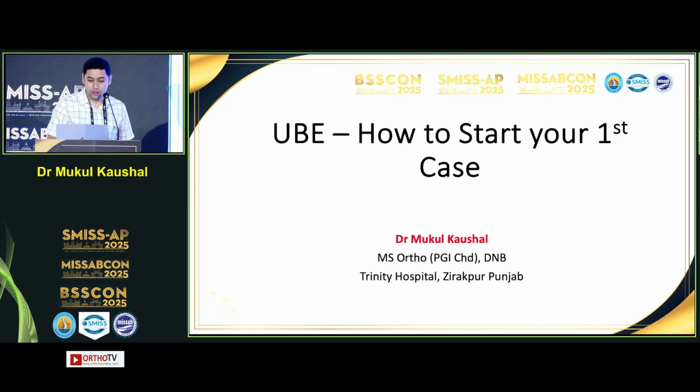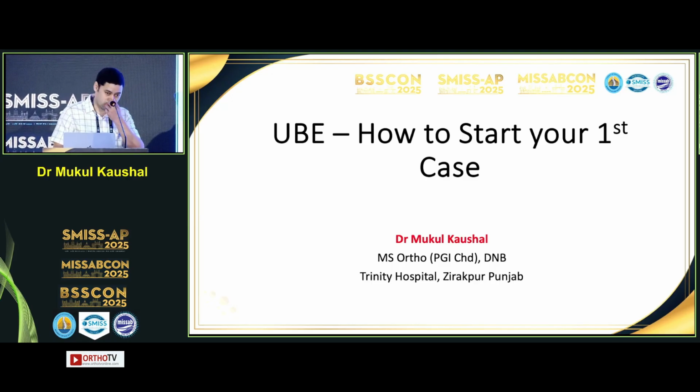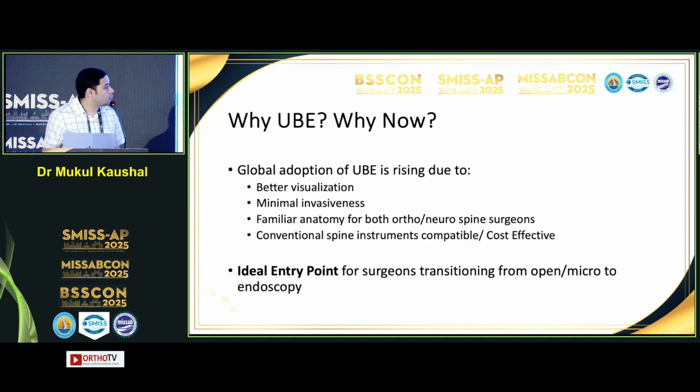I'll be talking about UBE, how to start your first case. So this is all just planning before the OR. So why UBE and why you should adopt it now? It gives us a much better visualization.